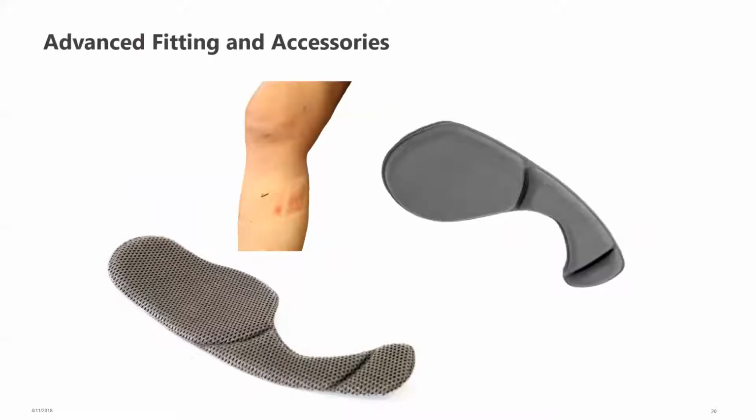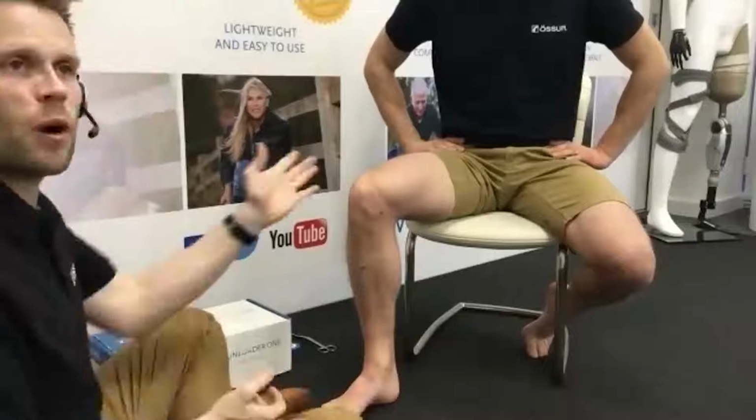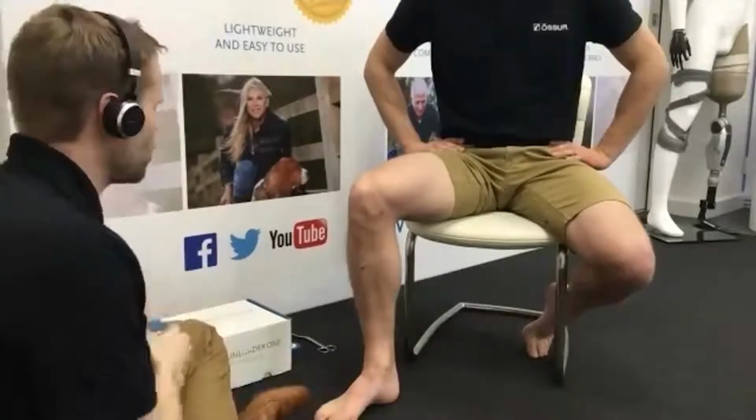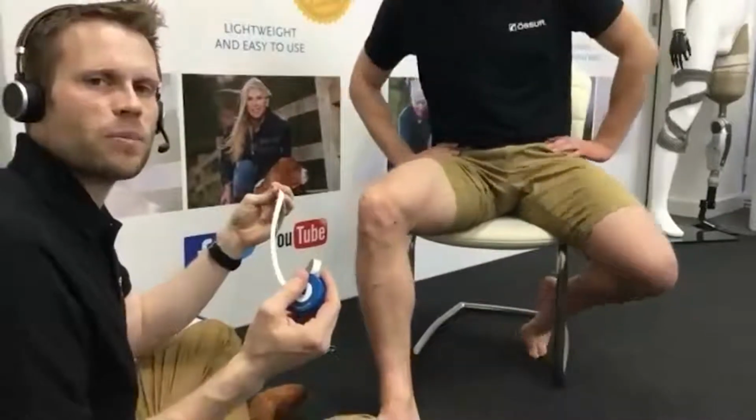So we're going to go on to advanced unloader fitting and accessories. So I'm just going to move over to looking at the fitting camera. And we're just going to talk you through a standard fitting of the brace. Okay, so we've got Pete here, and we're just going to go through a standard fitting. But before we do that, we're just going to take a quick measurement of his leg.